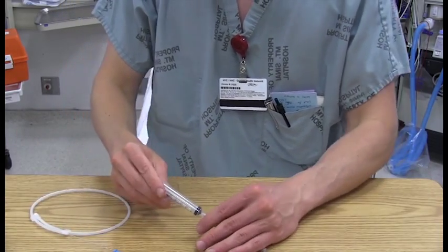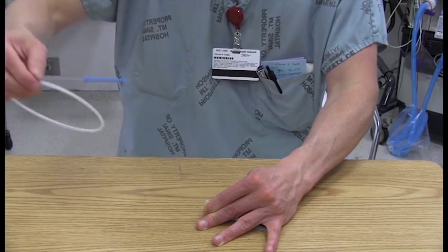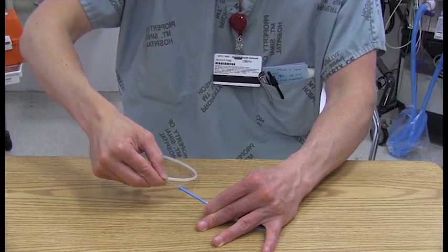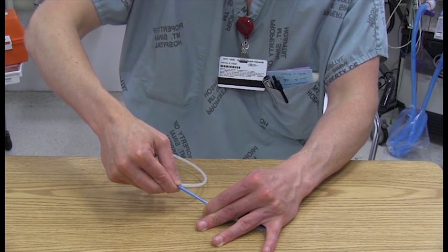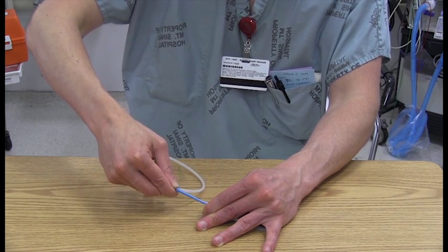So the micro skill is you now practice adding in, disengaging your hub, taking the wire, and the idea behind this is to put the wire in the hub in such a way that your first advance gets you very close to being outside or even outside the tip of that needle. Because once that tip of the wire is in the vessel, you're in good shape.